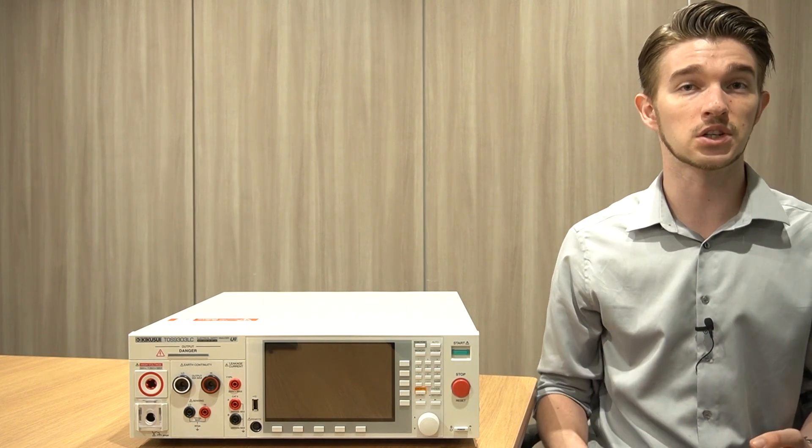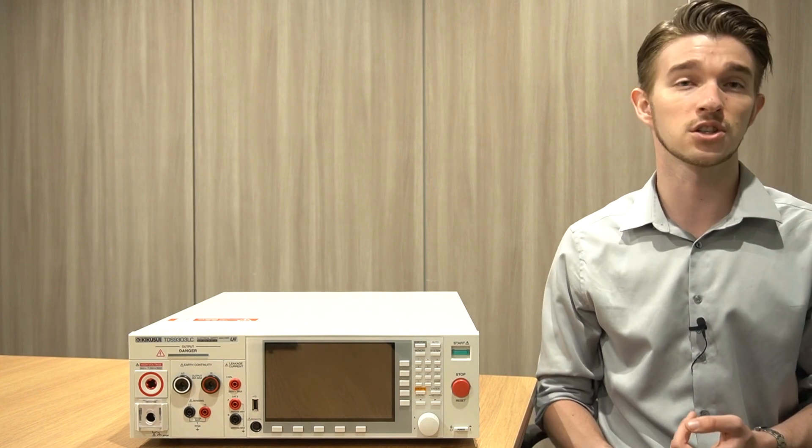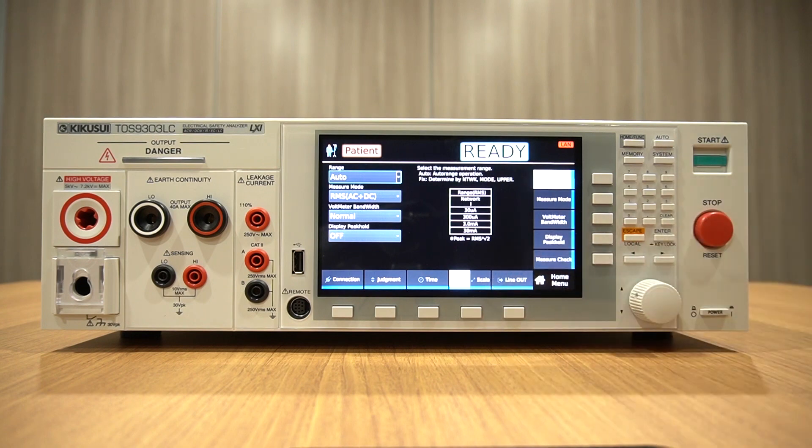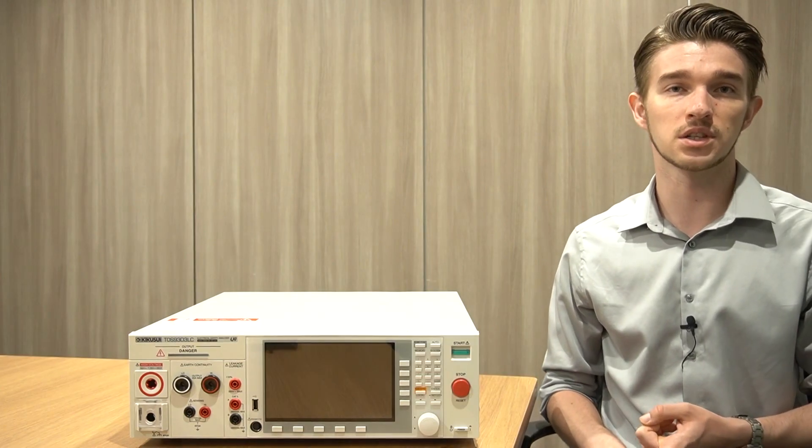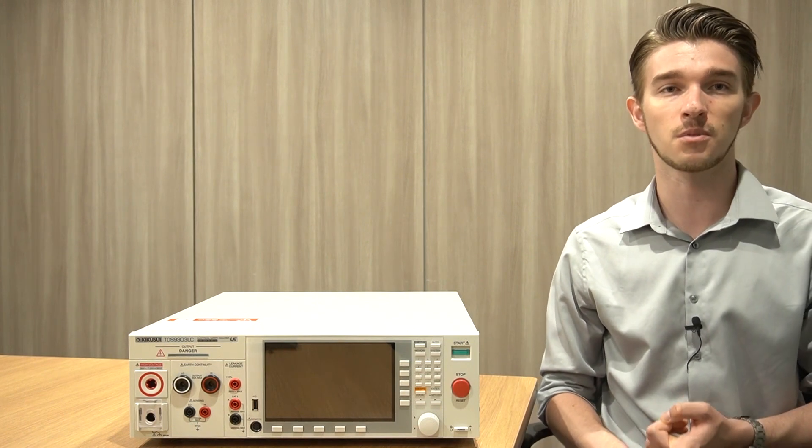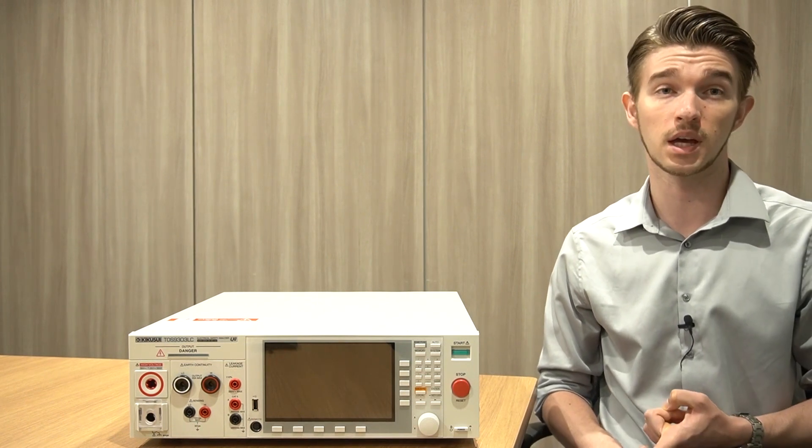Another critical feature in patient leakage current tests is the measurement range. You can access this by pressing the measurement button and then pressing Range. You can select your desired range in either peak or RMS measurements, which can detect currents as small as 0.1 microamps.